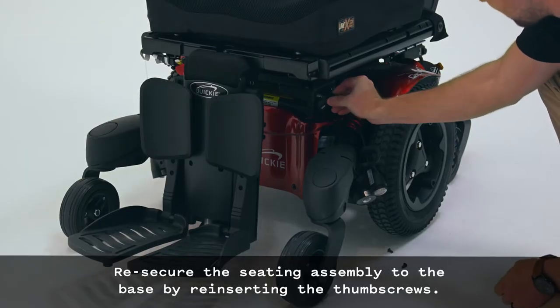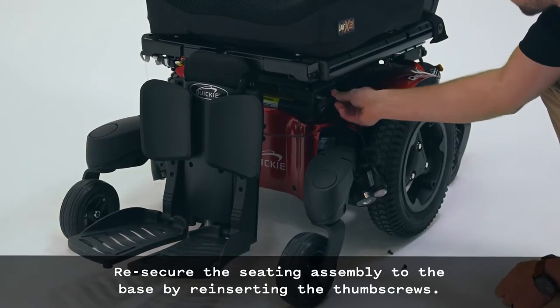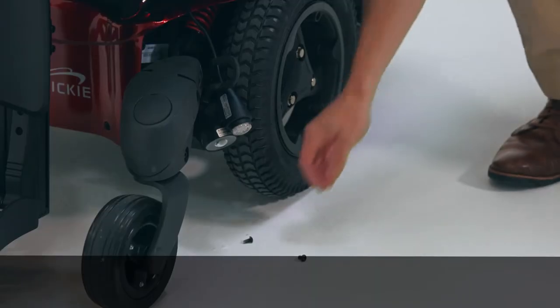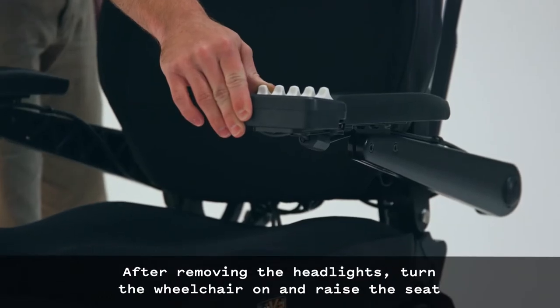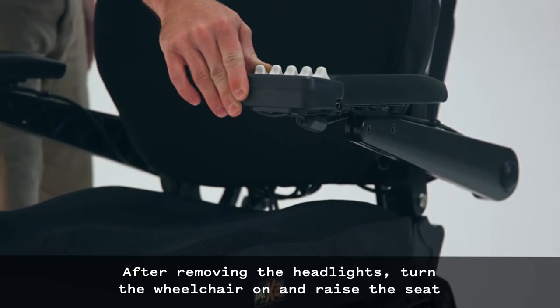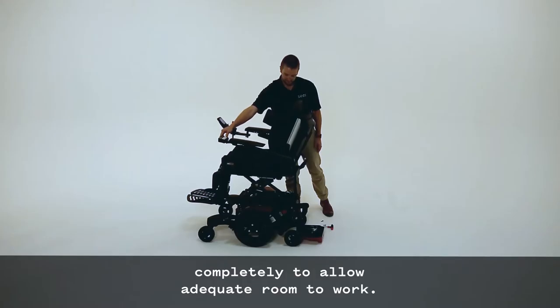Re-secure the seating assembly to the base by reinserting the thumb screws. You can discard the screws that you removed in this step. After removing the headlights, turn the wheelchair on and raise the seat completely to allow adequate room to work.